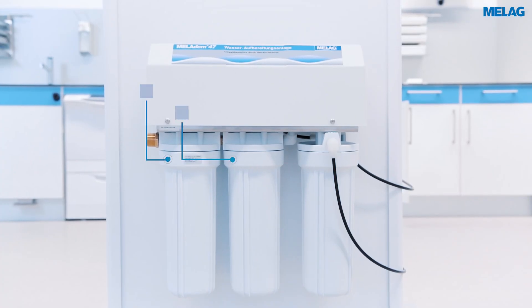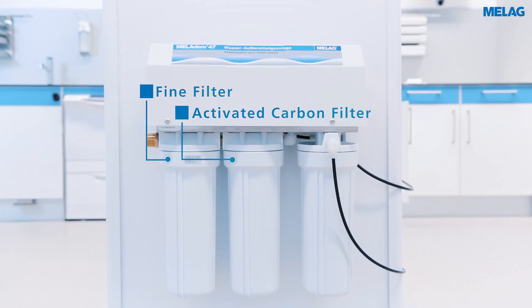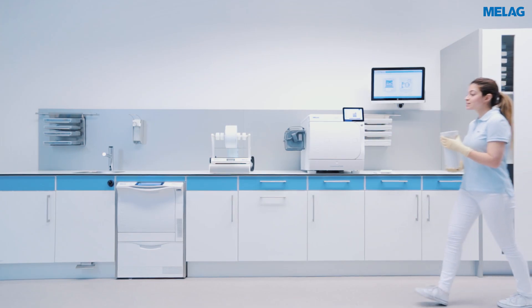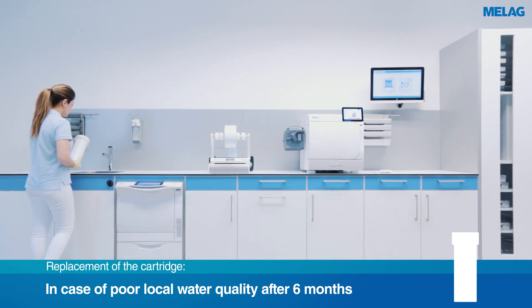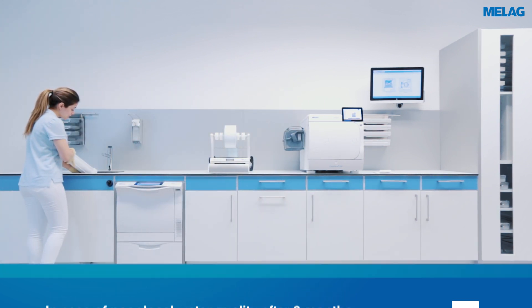Also, please replace the fine filter and the activated carbon filter once a year. Pour the water in the container of the fine filter and activated carbon filter down the drain and rinse the filter housing thoroughly with tap water.